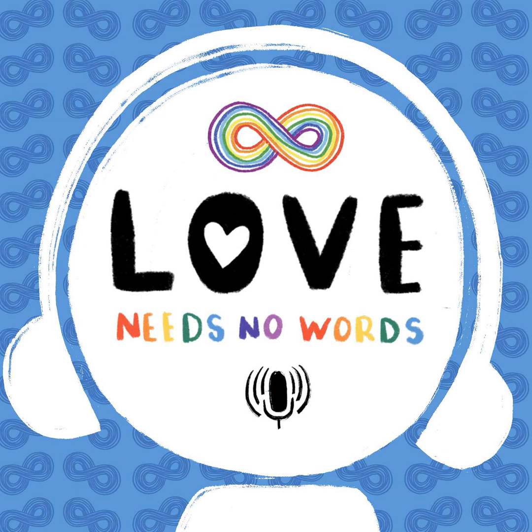There's no argument that AAC does help speech. It encourages speech, it supports speech, it does not hinder speech. If it's going to be possible for a child to learn more speech and learn to speak, then AAC will make that more likely, and it'll make it more likely that they can use their speech in a way that works best for them as well, and make that easier for them. Because I guess it's repetition, isn't it? If they're pressing the same icon to get what they want, they're hearing that same word over and over again.